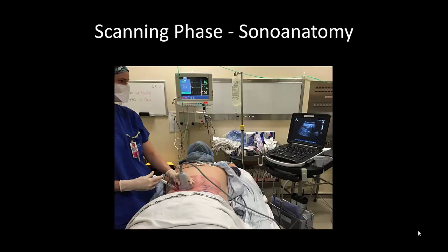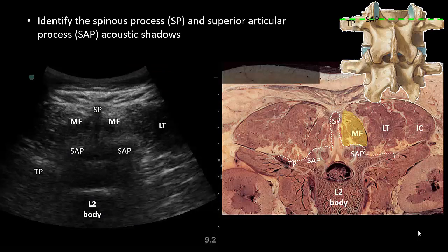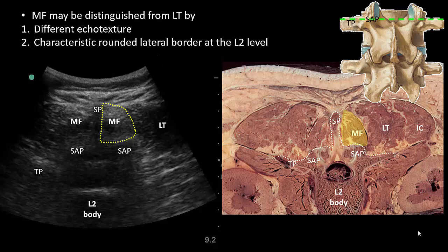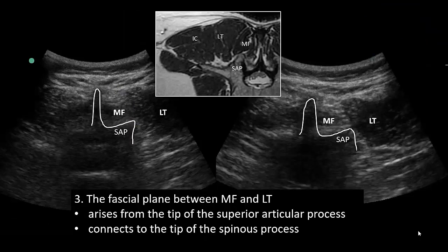With the probe in a transverse position over the midline, the acoustic shadows of the spinous process of the underlying vertebra are identified together with the superior articular process and transverse process. Using these as landmarks, multifidus can be identified as the muscle immediately adjacent to the midline. Longissimus thoracis is lateral to multifidus, and the plane between them can be identified using the following characteristics. First, the two muscles are usually different in echo texture. Second, at the level of L2, multifidus has a characteristic rounded appearance; at lower lumbar levels it is much smaller and more triangular. Third, the dividing plane usually runs between the tips of the superior articular process and the spinous process, so these can be used as landmarks. This MRI image shows the fat-filled planes between the muscles and how they communicate with each other.